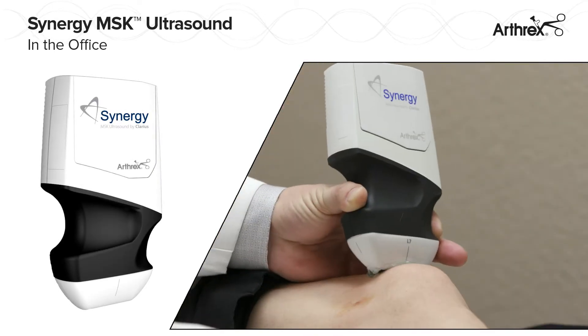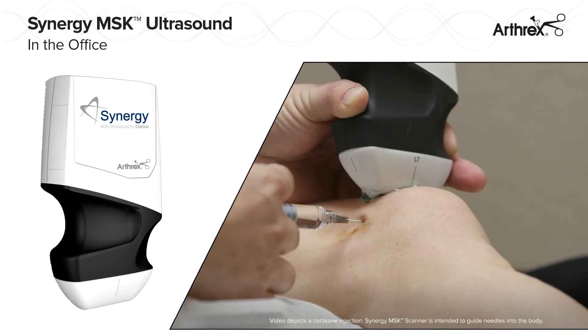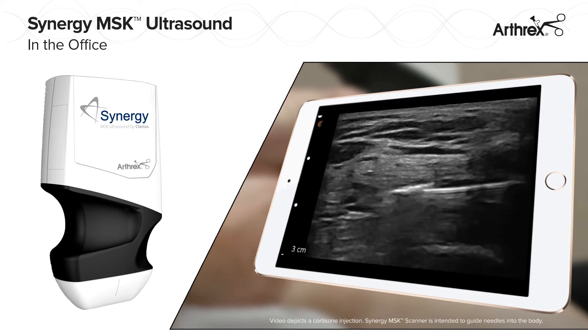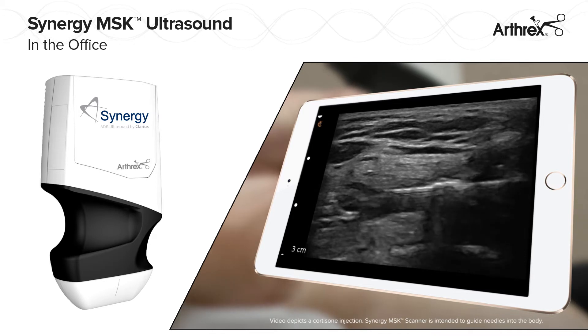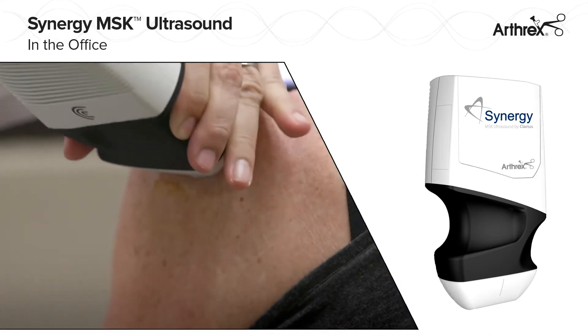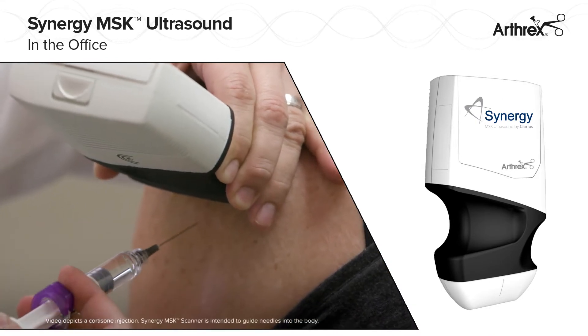The Arthric Synergy MSK Ultrasound is a high-resolution, wireless, handheld ultrasound device that seamlessly transmits real-time images to an iOS or Android mobile device. Synergy MSK Ultrasound enables quick examination of patient anatomy and needle guidance under continued visualization.